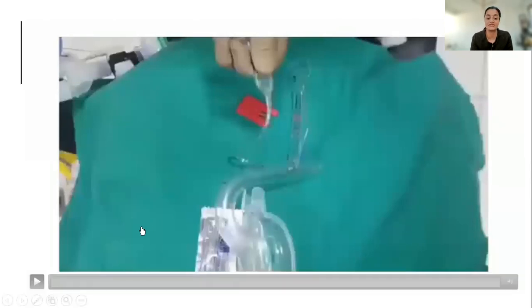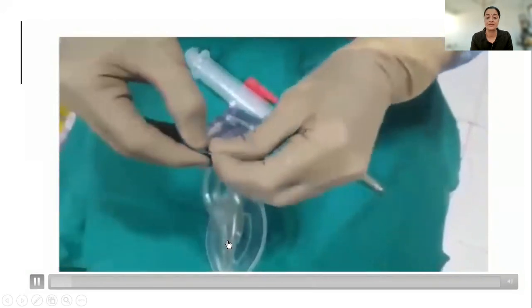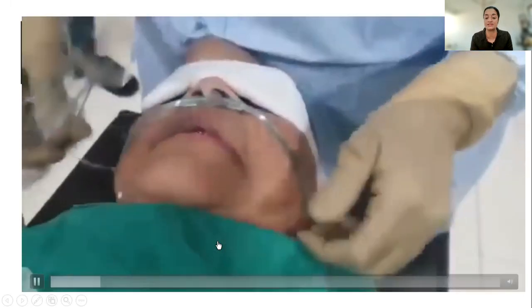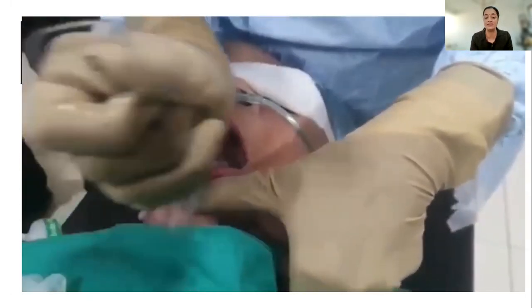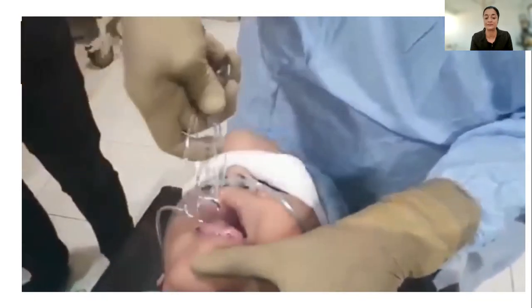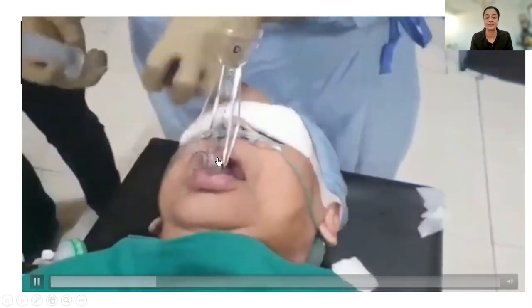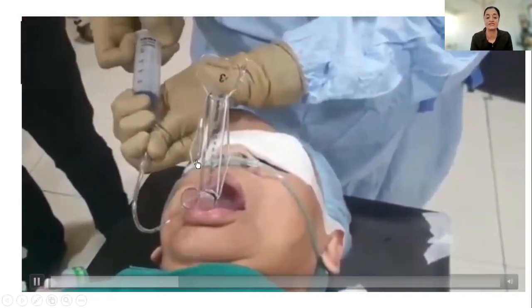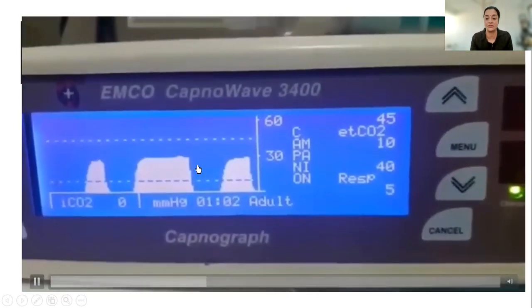The cuff is deflated completely. Lubrication which comes along with the set is used to lubricate nicely. This is an edentulous patient. The LMA is placed nicely using the rigid handle, it's inflated adequately, and the placement is confirmed with the capnograph.